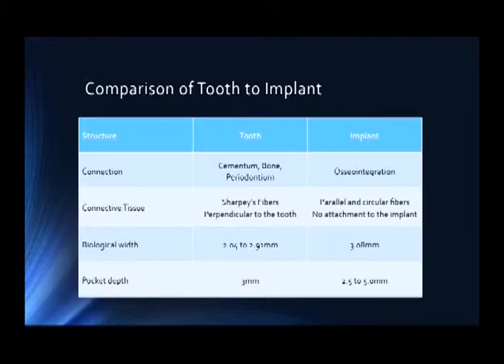So the fibers in the connective tissue run parallel to the implant, as opposed to the tooth, where they are perpendicular. So I made you this little chart just so that you could discuss that with a client if they're in that scientific mode and they want just a little bit more information. Then you have some key points here that you can go over with them about the way that it works.